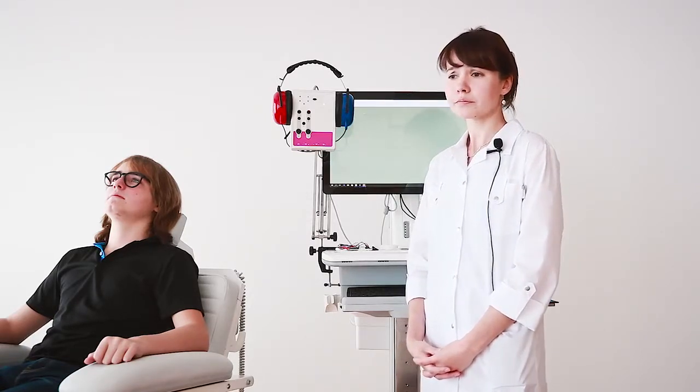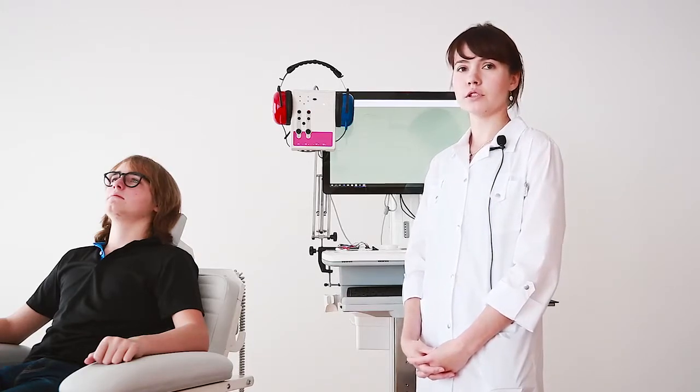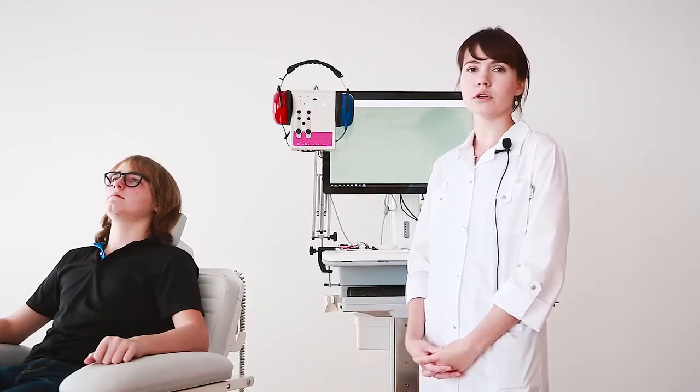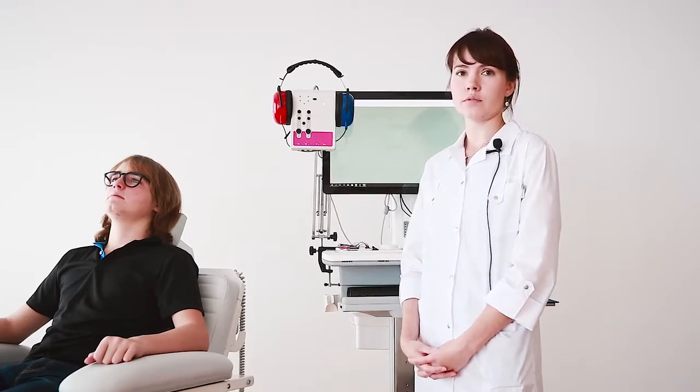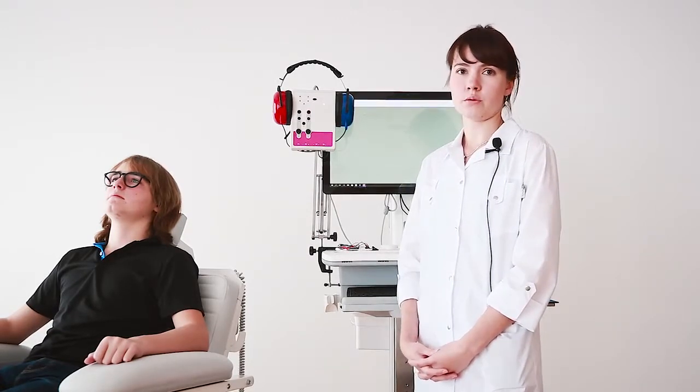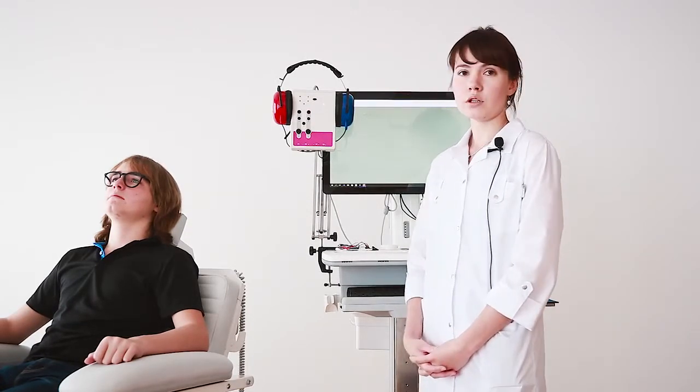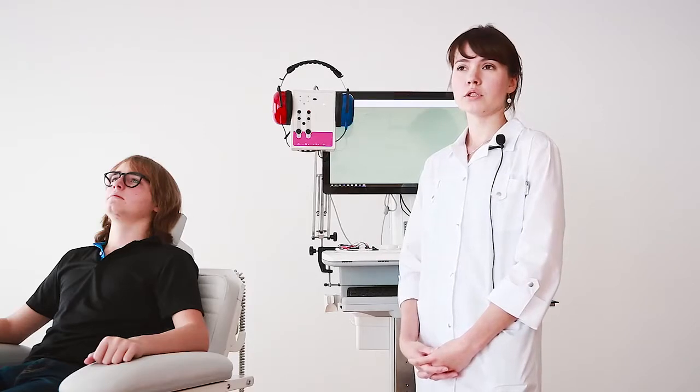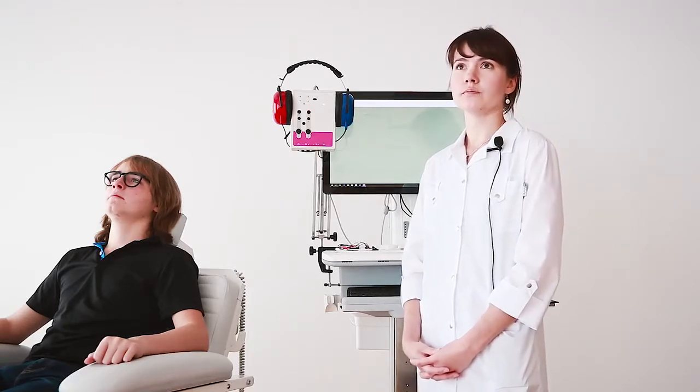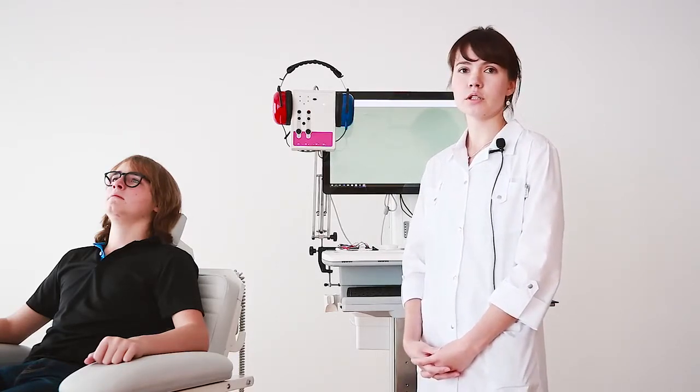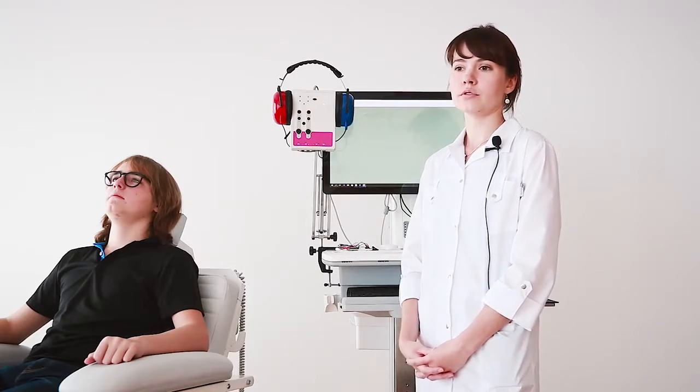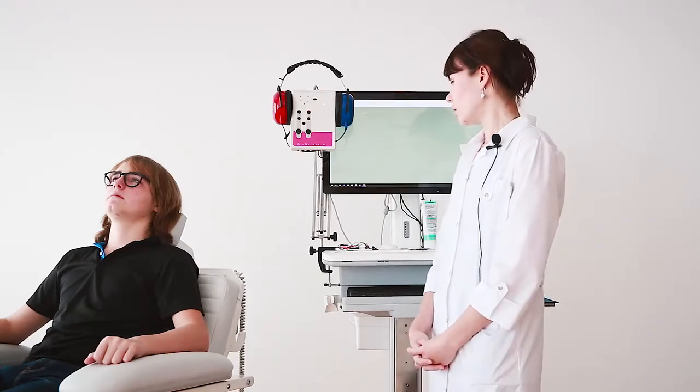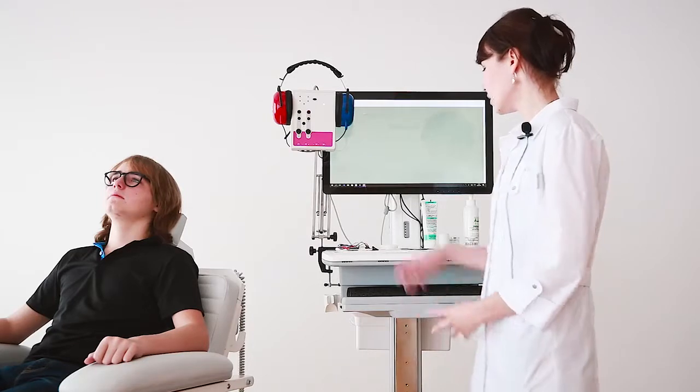This kind of test allows us to evaluate the state of the vestibular nerve and nuclei, in particular inferior ones. The ocular VEMP allows us to validate the state of superior nuclei and vestibular nerve.